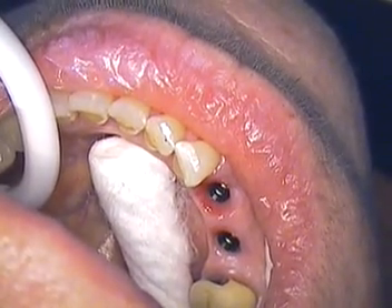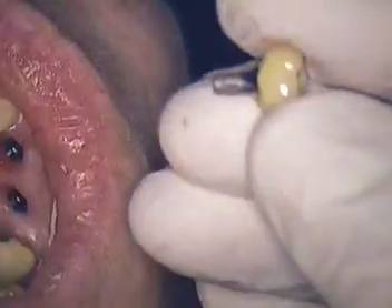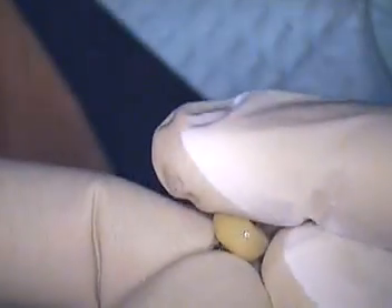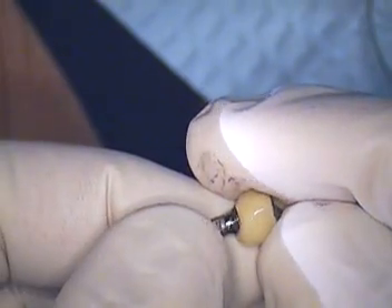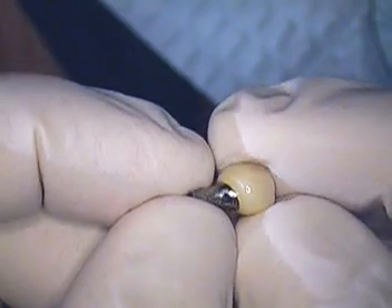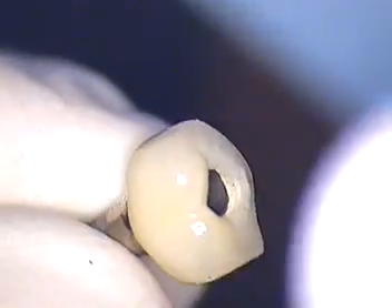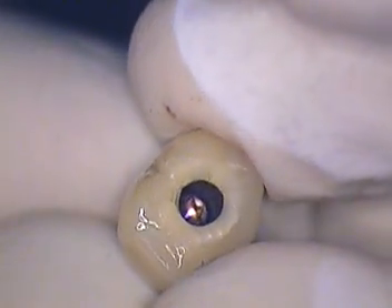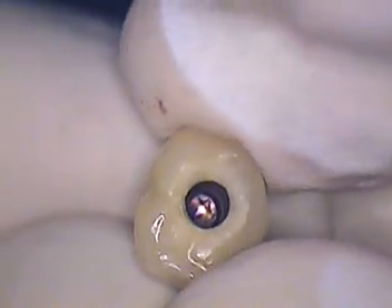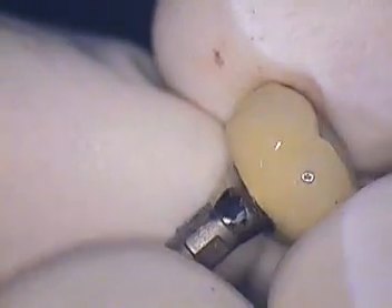This is tooth numbers 27 and 28. This is 28 — I'll show you what we've done to the undersurface of 28. Highly polished metal, trying to keep all the contours more convex than concave if it's subgingival. Nice broad contacts. We've also countersunk the metal and opaqued the top of that, and also acid etched so that we're ready now to receive the composite plug.